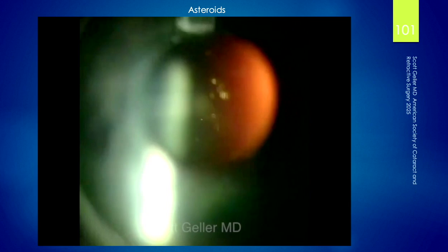camper. The other thing you need to know about asteroids, usually you see them without a PVD. They're just diffuse throughout the vitreous. If you have a PVD with asteroids and you break the hyaloid, you will not have a happy patient, because the asteroids will go behind the hyaloid, and rather than having a diffuse little shadow or whatever they perceive, they all of a sudden see more stuff because the asteroids are right against the retina because you broke the hyaloid. So be careful. Be careful with this kind of stuff.